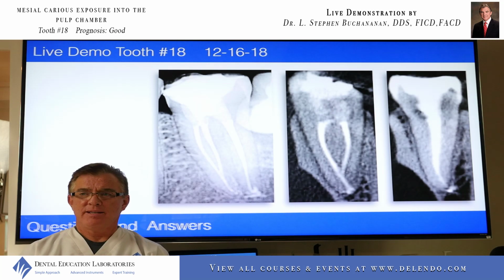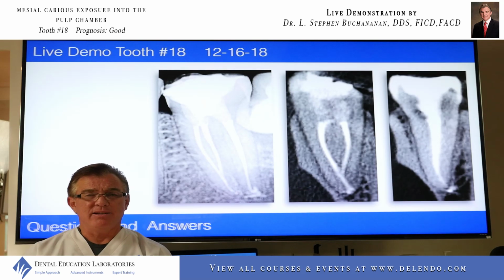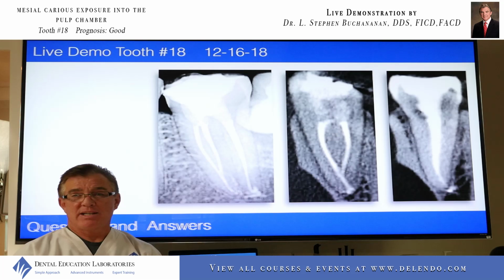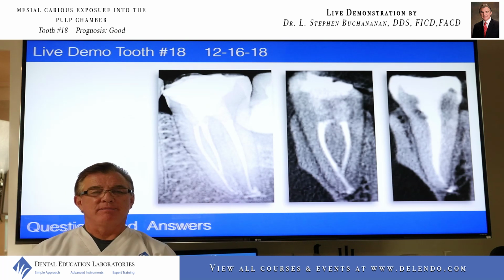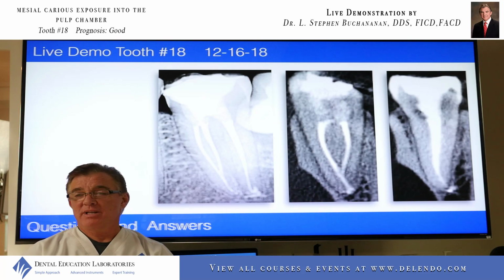You have to be willing to accept some cases that turn out less than ideal, but when live demos are done and they don't turn out ideal, that's actually the best experience for course attendees, because they want to see how you get out of trouble when everything doesn't go perfectly. But we're working on the setup and the technology. We need to get cameras and microscopes hung from the ceiling instead of on stands around here. But trust me, we're going on our 3rd live demo next week.